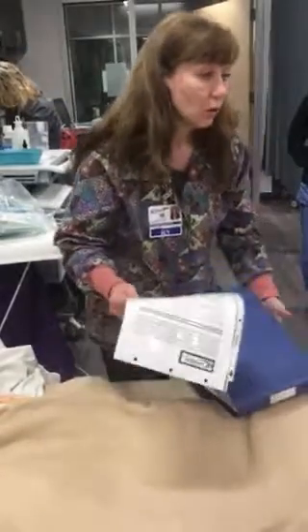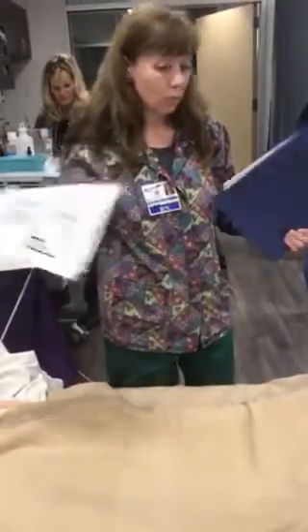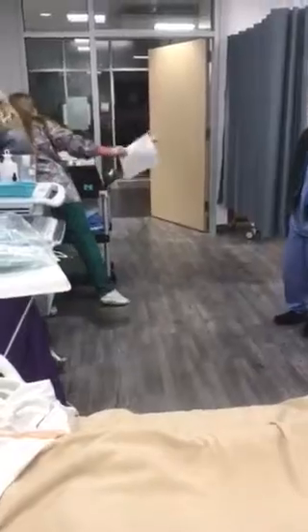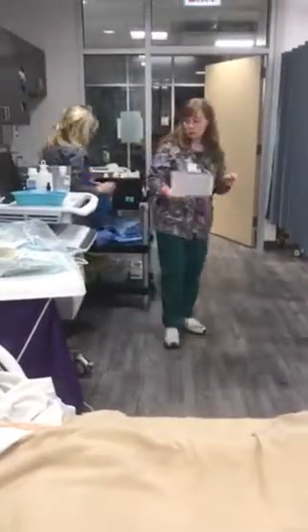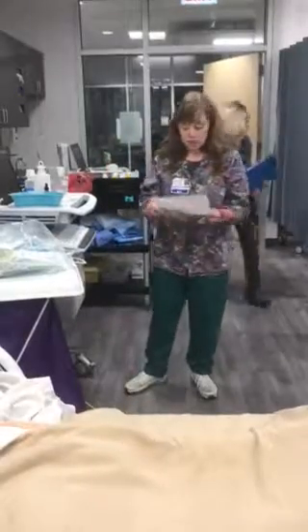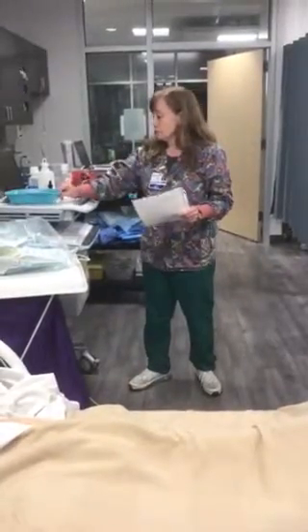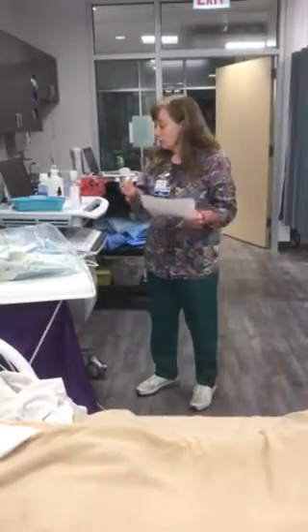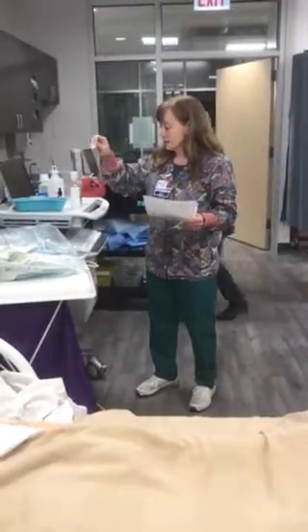Now remember, only if it's a first time order do you need to compare the orders to the MAR. But we're pretending pretty well here today, so we're going to go ahead and do that. So next I would take this into my patient's room, or into the nurse server, wherever I'm going to get the medications. So what am I going to do first? I want to make sure I have everything that I need. You could tear off a couple labels, because you're going to use plastic for this one.